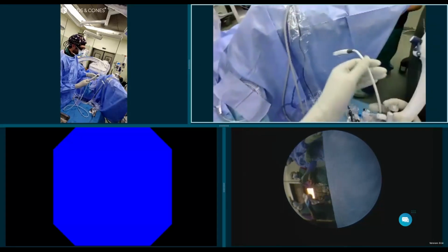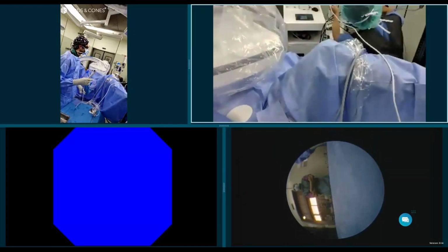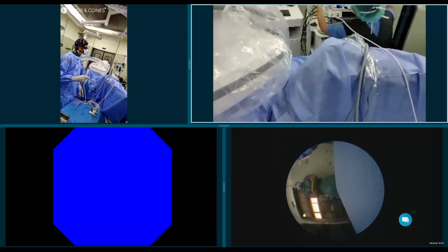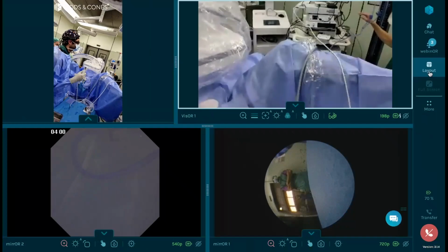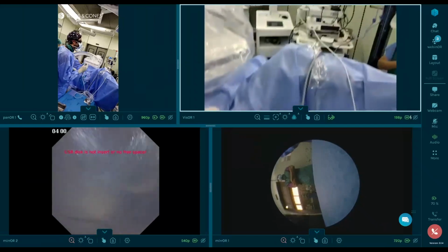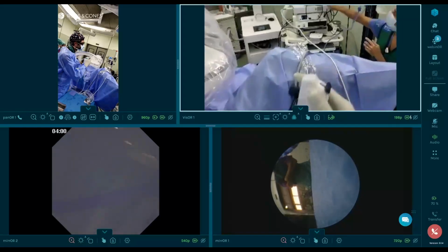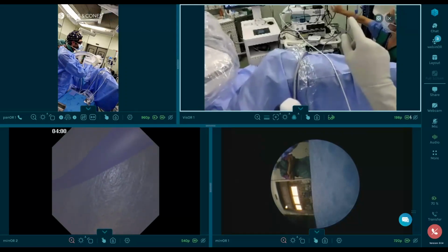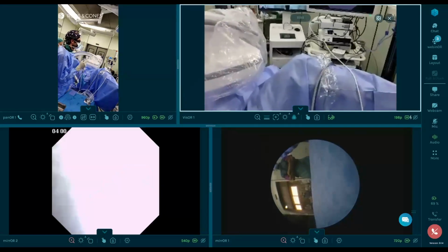So the ureteroscope is plug and play. We just leave it here to my staff, and you can see you just plug it. Perfect. Puedes poner swap, por favor. Sí, sí, excelente. And we're going to connect the aspiration here. Puedes poner swap, el botón de abajo. Ahí, swap, exacto. Y ahora pip pop. Pip pop. Está en verde, ahí. Dale, otra vez. Excellent.